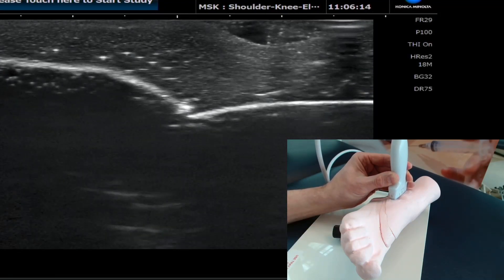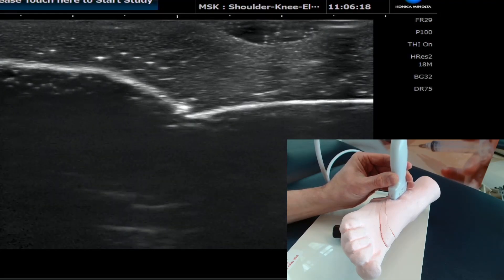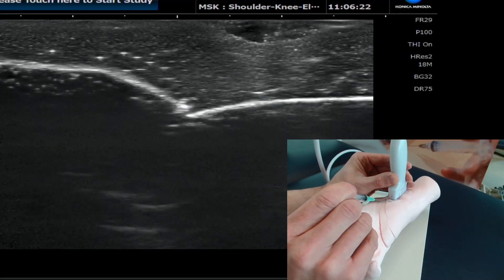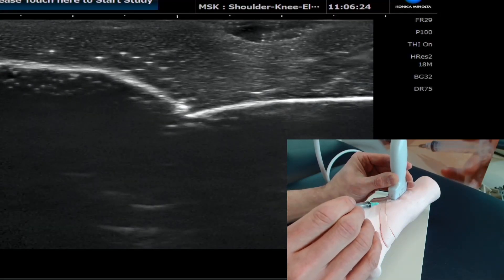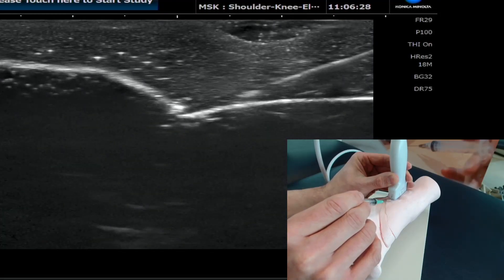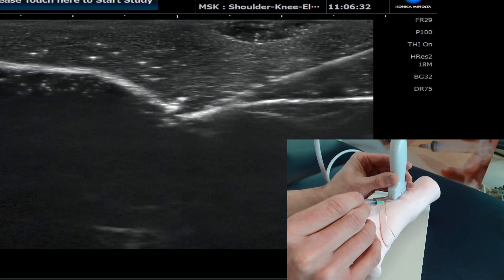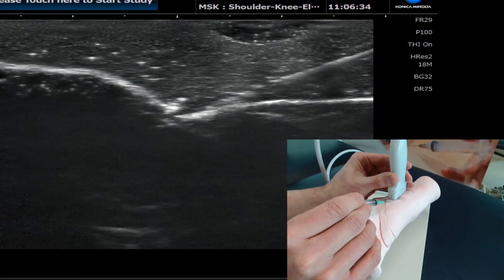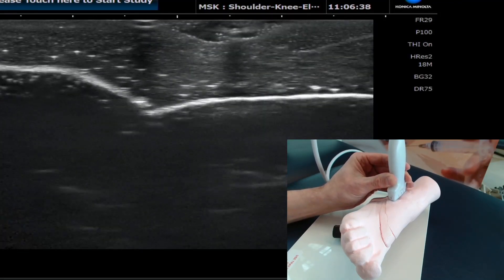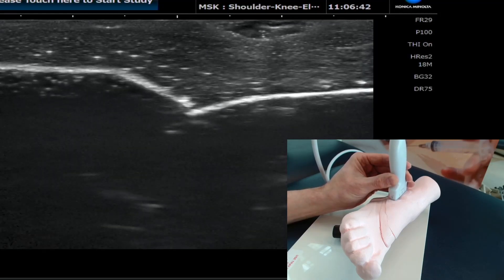One top tip regarding patient position: ask your patient to lie in side-lying so the ankle is in this position. You can see the probe face very clearly if you're sitting towards the end of the bed. In comes the needle tip and we inject nicely into the joint recess. Often there would be a small pocket of fluid or synovial thickening that you could access to perform the injection. I hope that helps.